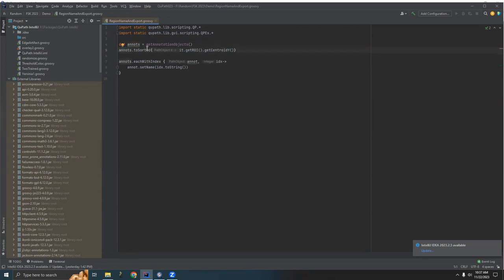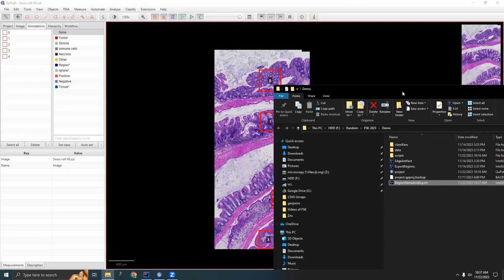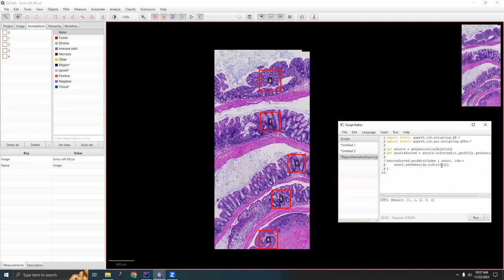The toSorted does not work in place. It creates a new variable. So we're going to have to give that a name, and I'm going to call it annots_sorted. And now instead of looping over annots, we're going to loop over annots_sorted. Let's drag that in. And okay. Now it has renamed the boxes 0, 1, 2, 3, 4 from top to bottom.